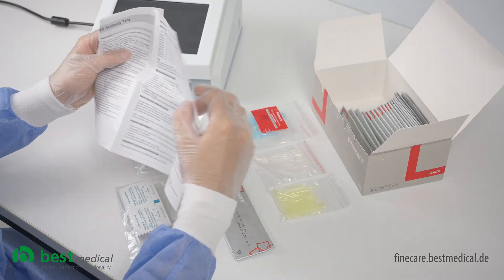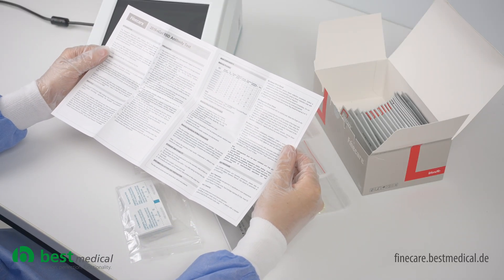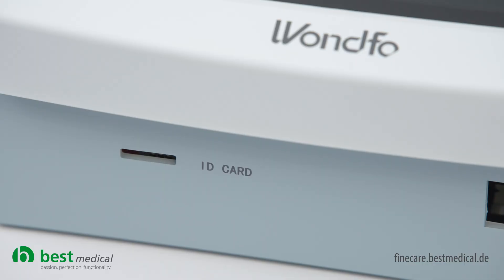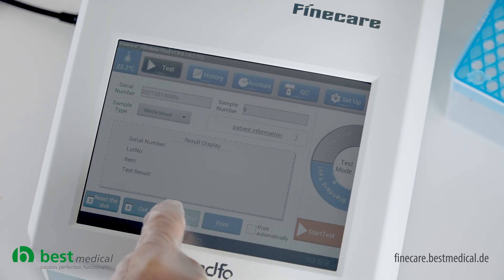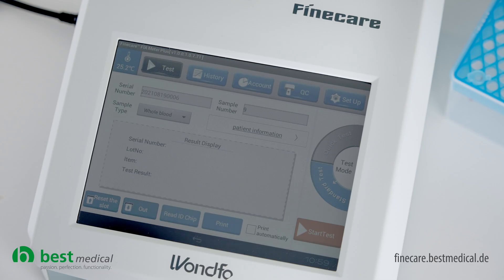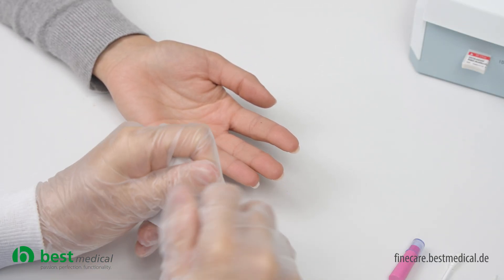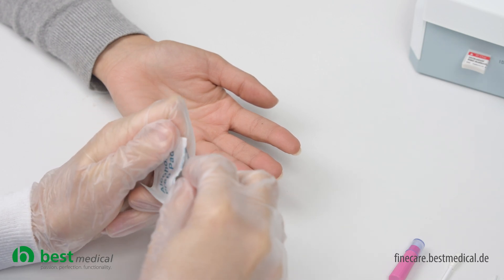First, read the instructions for use. Then insert the ID chip into the slot labeled ID card on the FineCare universal test device. After that, confirm the test type on the touch screen by pressing the read ID chip button. The test can be performed with blood plasma, blood serum, or whole blood.